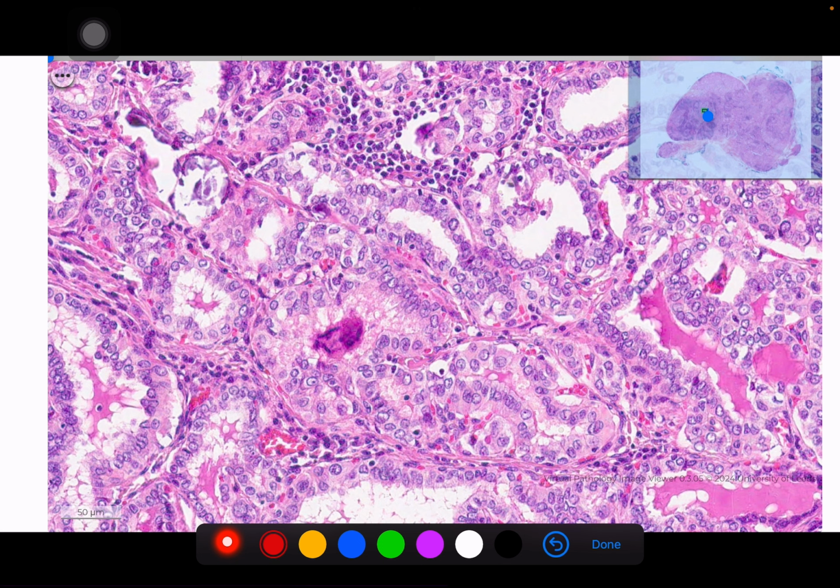So you can make out the papillary projections. Okay, this is all papillary projections. Each of them is a papillary projection, and you can see there's a fibrovascular core in the interstitium of the projections, and the cells are made up of optically clear nuclei, or what we call Orphan Annie nuclei. And most importantly, you can see this material here, what we call psammoma bodies.